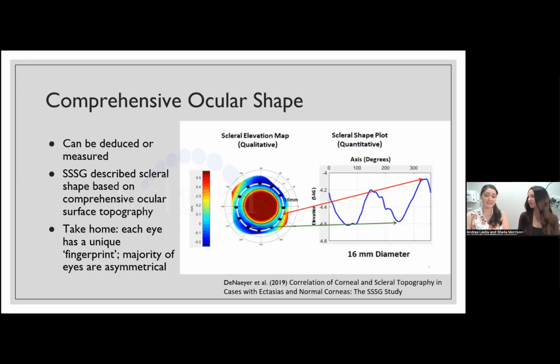And now even with the addition of impression-based or digital freeform, what do we say for our practice? We end up with a lot of patients that have already failed out of other lens designs. So quite often we are doing probably a higher volume of freeform impression-based. We get some crazy cases in our area. On average, it would be a mix of toric, quad, and then freeform being like a third of it. I would say right now, at least for my patients, freeform is maybe 10%. I'm definitely higher, just the way it goes.